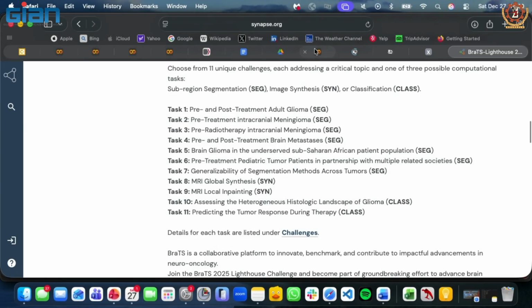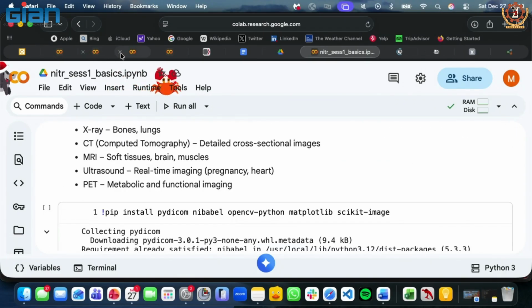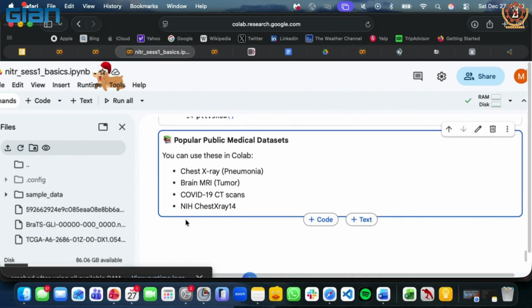So these are a few data sets which come very handy if you want to train some basic things to try out as a start. And then from there on, you can move on to much denser deep learning projects. I'll try to share a Google Doc maybe on the last day, where you will have the links to access all these data sets and a few basic codes that you can use for pre-processing. So any questions on the basics of medical imaging?